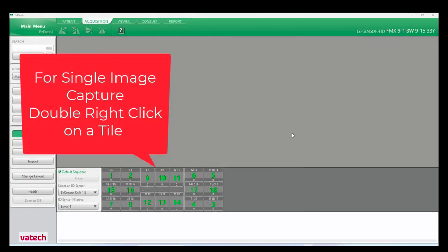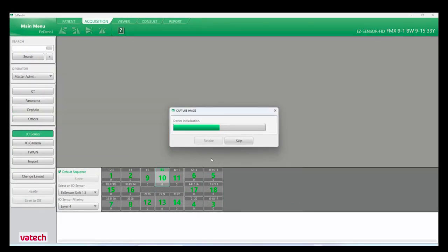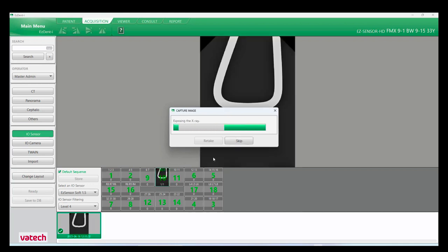For single image capture, double right-click on a tile. This allows the user to capture a single image out of sequence.